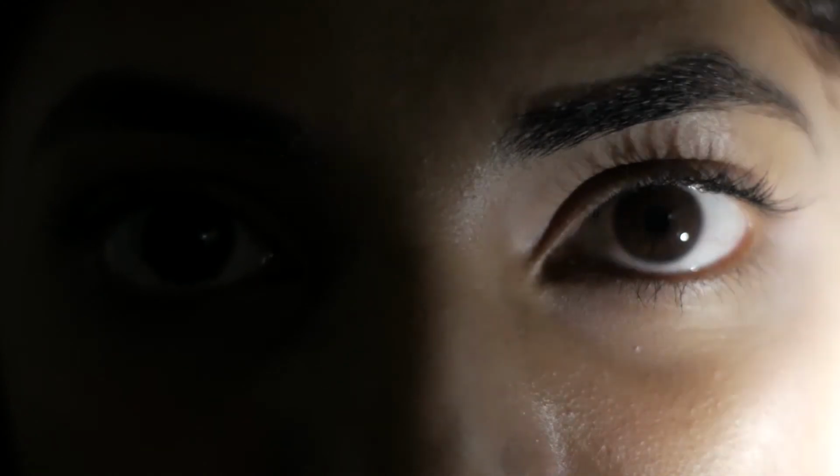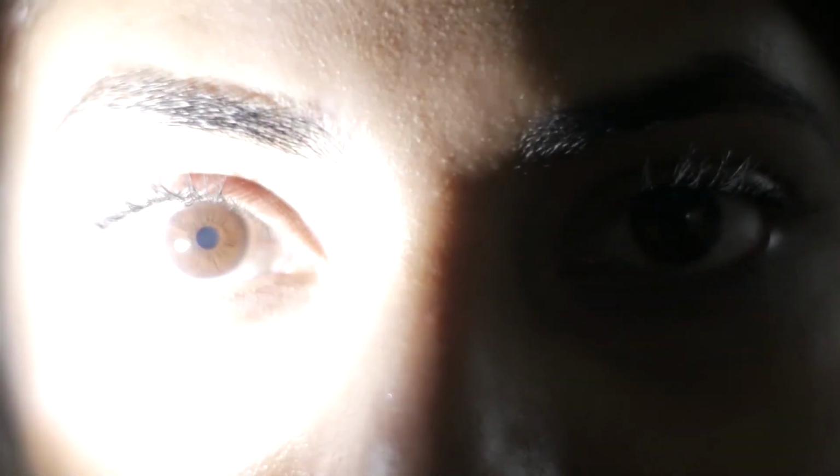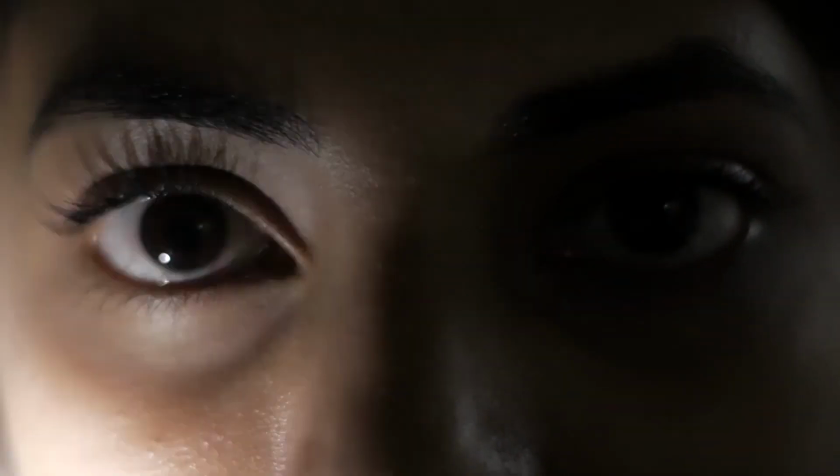Now let us perform the swinging flashlight test. The swinging flashlight test is a clinical test for functional impairment in the optic nerves. In dim light, note the size of the pupils. After asking the patient to gaze into the distance, swing the beam of a pen light first into the right pupil and then into the other. Normally, each illuminated eye constricts promptly. The opposite eye also constricts consensually.